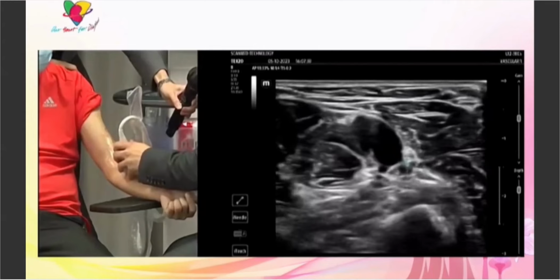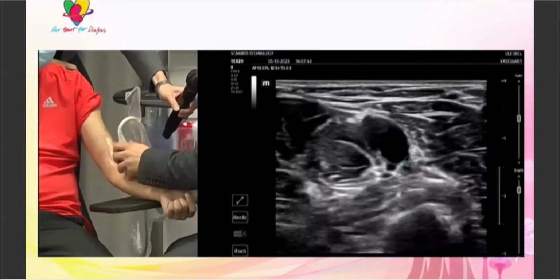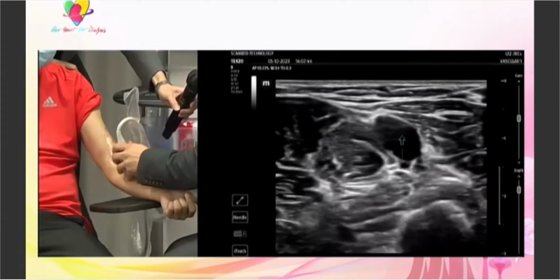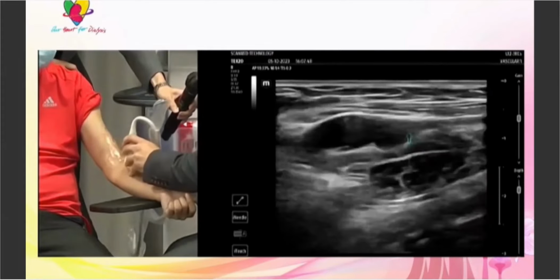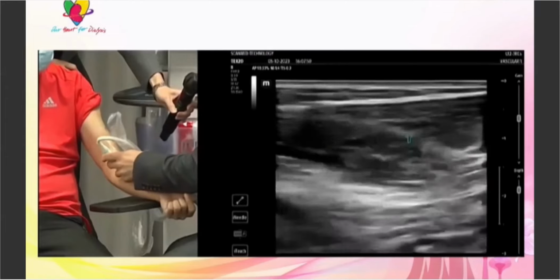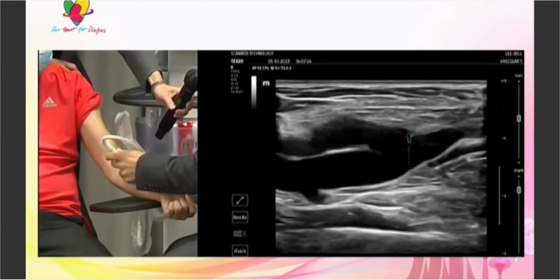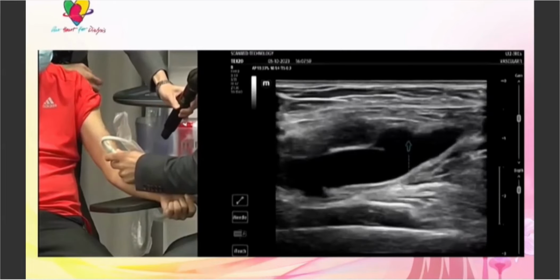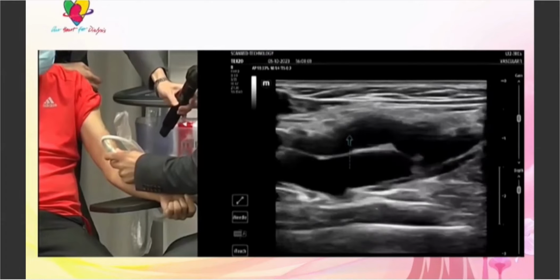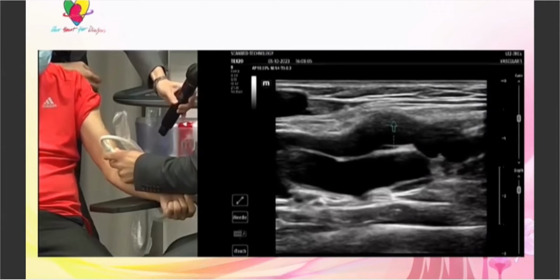We see how big it is. So this is the anastomosis. I would measure the anastomosis in the transverse mode, but you see it's big enough. And then I would visualize the anastomosis in the longitudinal projection. That's the anastomosis in the longitudinal projection. Here's the inflow artery, outflow artery, the anastomosis, and the juxta-anastomotic radial vein. And you see it's slightly pre-stenotically dilated here.